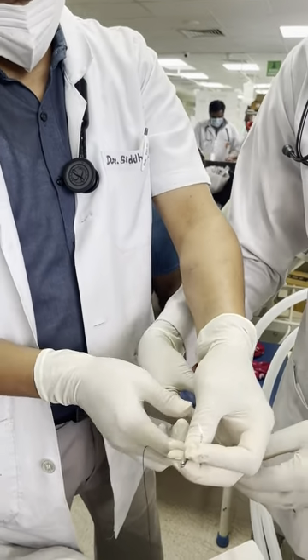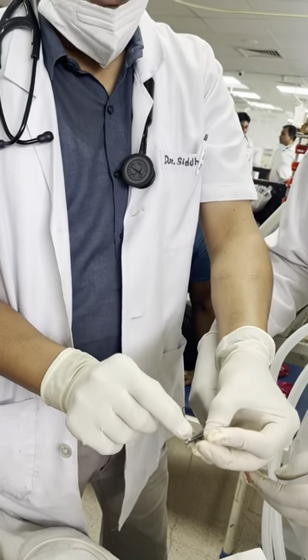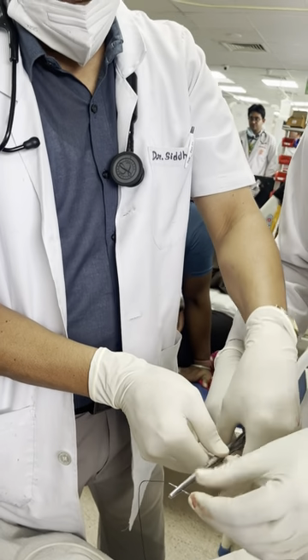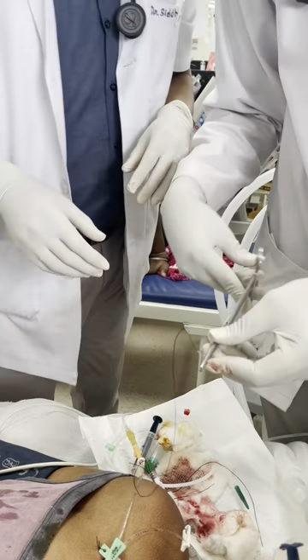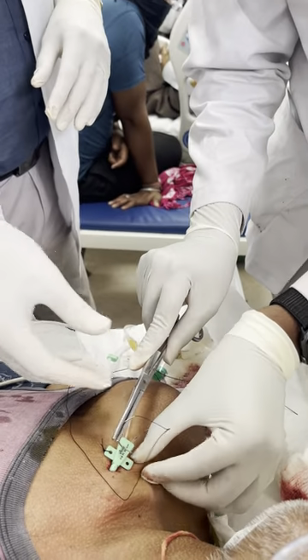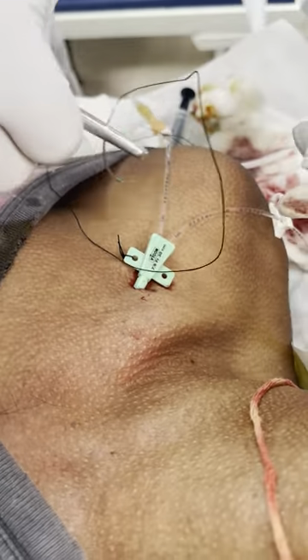We are not locking at the tip. We are not locking at the eye. This is the eye of needle, this is the tip. We lock somewhere here to create a better grip.